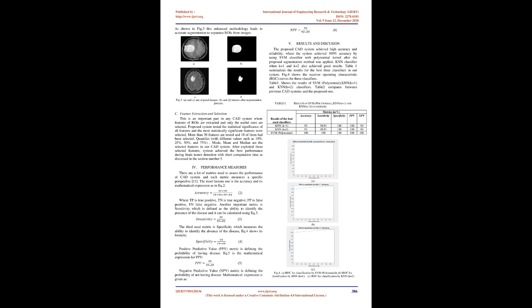3 classifiers were used: support vector machine, SVM, k-nearest neighbors, KNN, algorithm, and pattern net. The authors found that the combination of complexity measures and texture features with the pattern net classifier achieved the best accuracy, 98.9%. When they used SVM, the best achieved results are 96.7%, 94.6%, and 94.4% for accuracy, specificity, and sensitivity respectively.